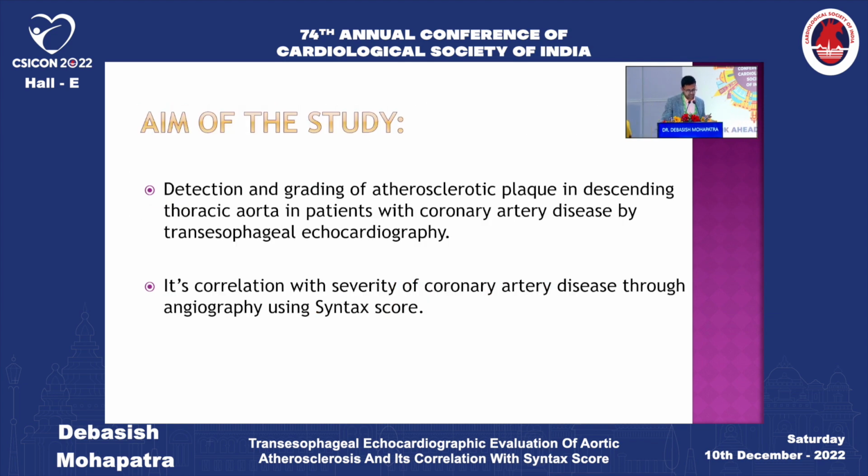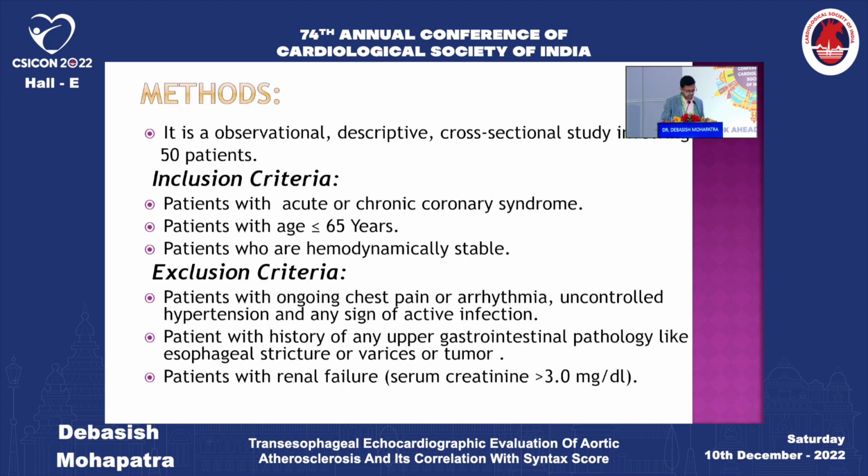So the aim of my study is detection and grading of atherosclerotic plaque in the descending thoracic aorta in patients with coronary artery disease by transesophageal echo, and its correlation with severity of coronary artery disease through angiography using the Syntax score. It is an observational descriptive cross-sectional study involving 50 patients.